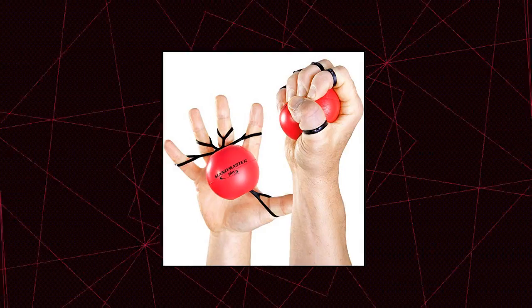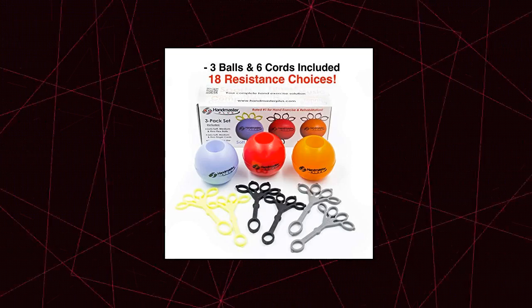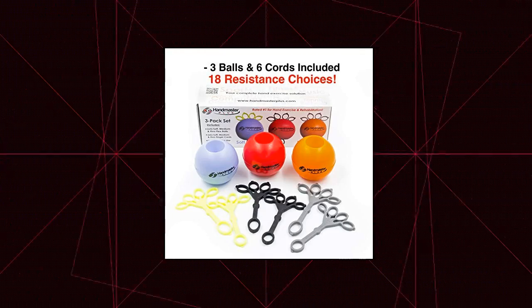Handmaster Plus Physical Therapy Hand Exerciser — the hand grip strengthener that strengthens all 18 hand muscles in one easy exercise. The hand exerciser that equalizes balance between the flexor and extensor muscles. The unique hand exercise that stimulates maximum blood flow for performance, wellness and rehab. All three balls are of same size.